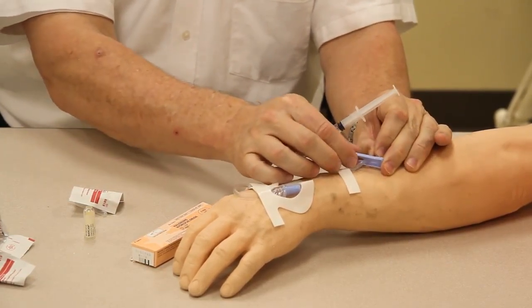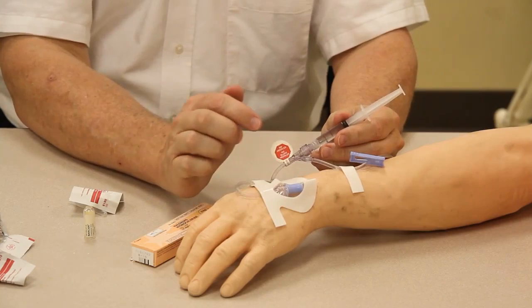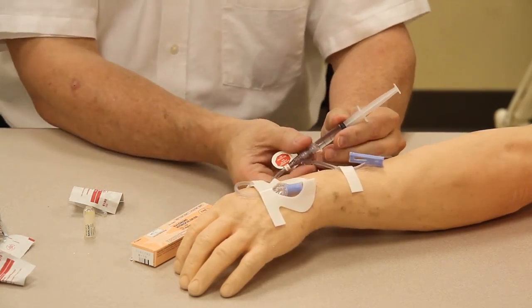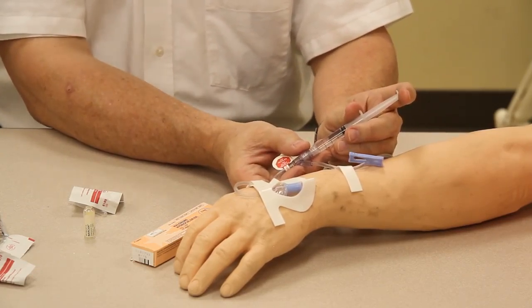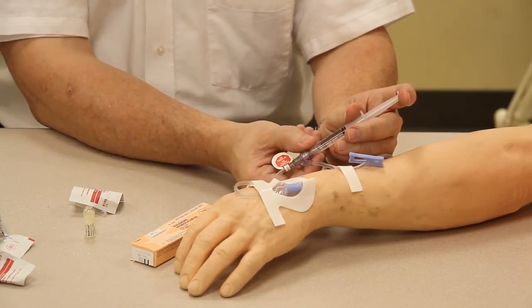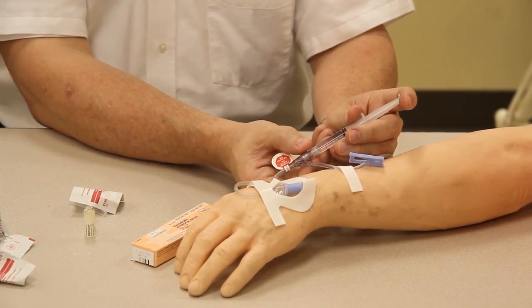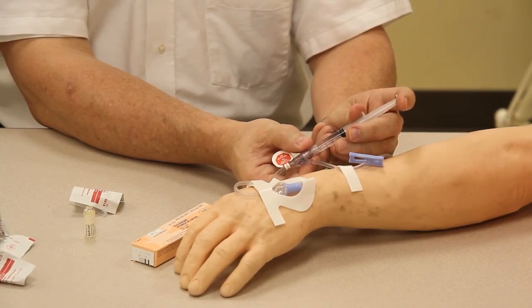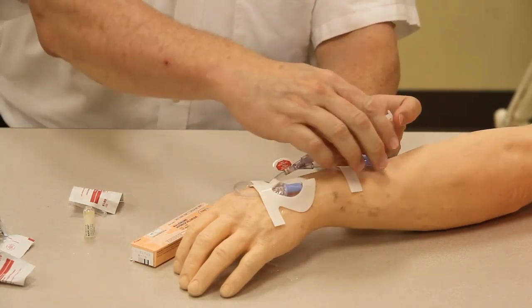The next thing I want to do is make sure that I stop all the flow that is coming out from my IV, which more likely than not is running at a TKO rate. And then I'm going to slowly push the medication in. More likely than not, your doctor's orders will actually say titrate to effect. And so I have 2 milligrams of Narcan in the vial, and I'm going to titrate that to effect. I'm going to watch for respirations. I'm going to watch my patient's condition, and I'm going to slowly titrate that in.